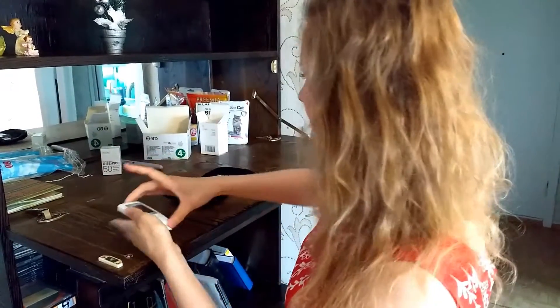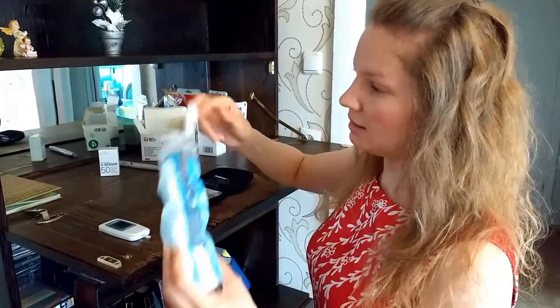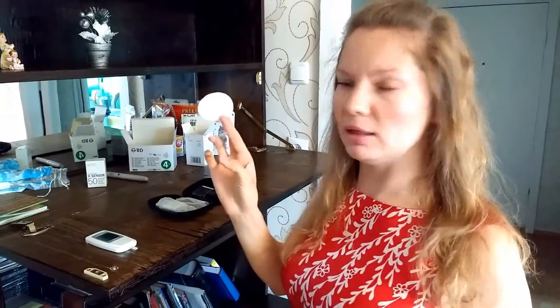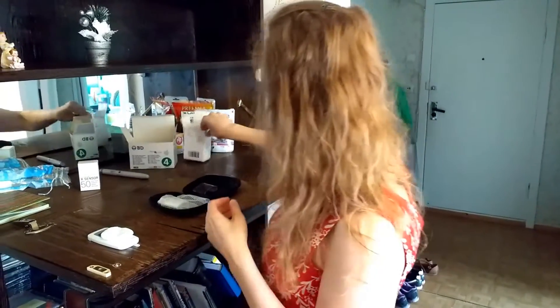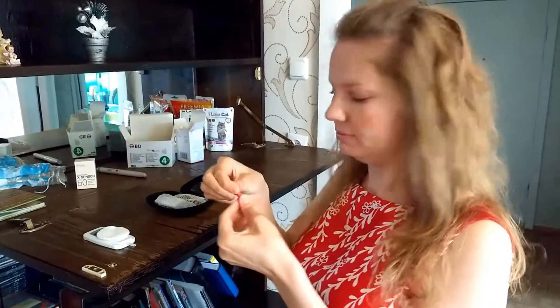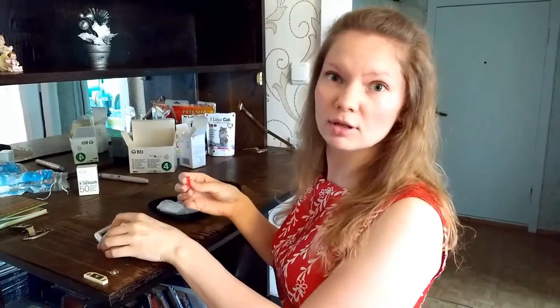And now it's ready. Then you take one cotton pad — it's been used by women for removing makeup. It's good to have a spare one. And you will also need a needle. You take the top off, and then you're ready to go.